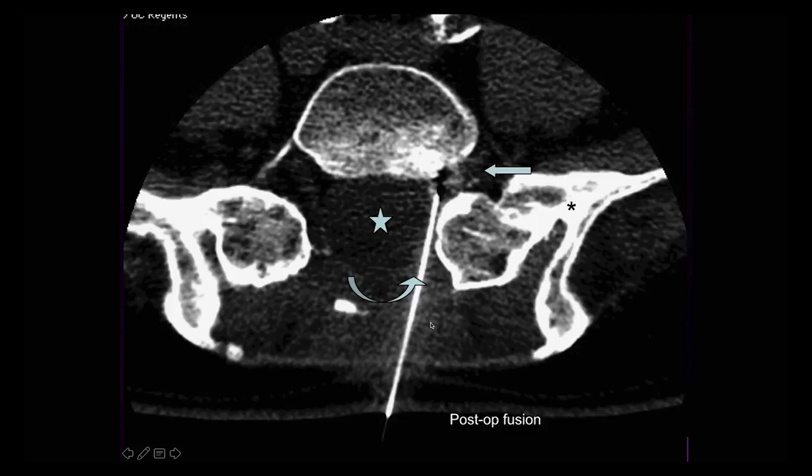So we can see with CT exactly where that spinal canal is, where the nerves are, so we can avoid it. And we can come in and skirt along that spinal canal and get right to where the nerve lives in the foramen. So many times postoperative patients have complicated anatomy that will not necessarily allow them to have the injections done under regular x-ray.